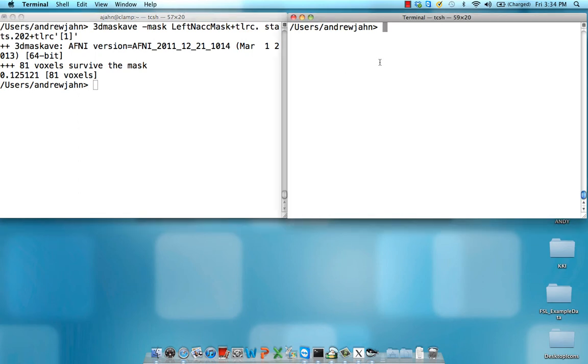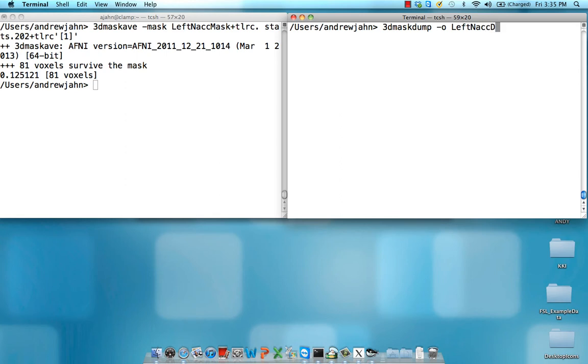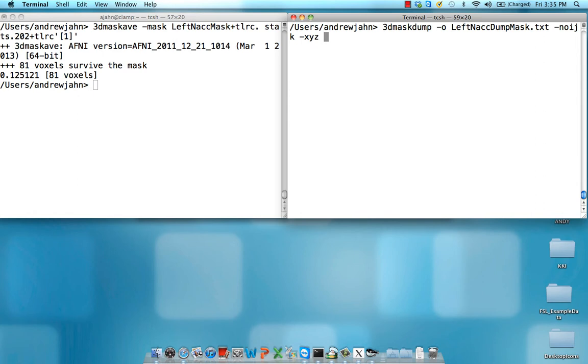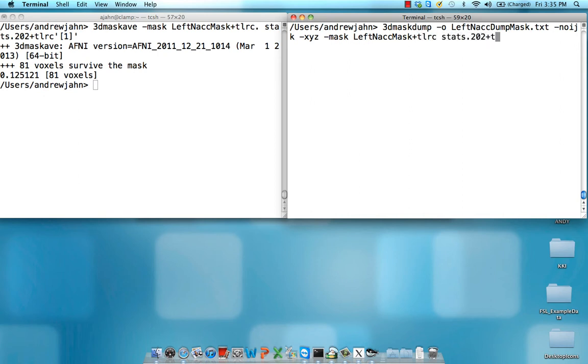The other way is to use 3d mask dump. So here I type 3d mask dump. I give it an output file, in this case let's say left NACC dump mask dot txt. I want to suppress any output with the raw voxel coordinates. I'm not interested in those. But I do want the RAI coordinates, so just type XYZ for an option there. Mask again is going to be left NACC mask plus TLRC. And again, I'm looking at the same beta in this statistical data set.